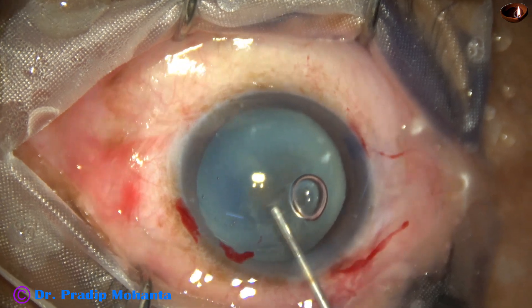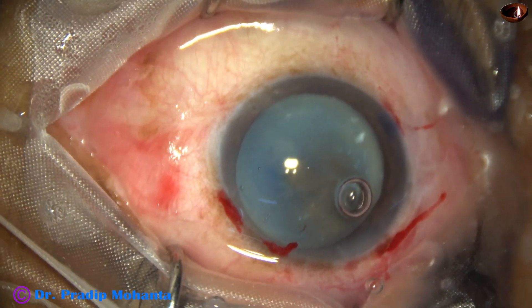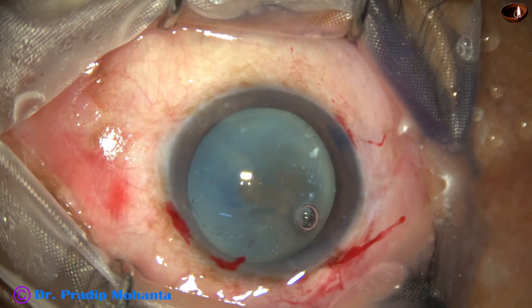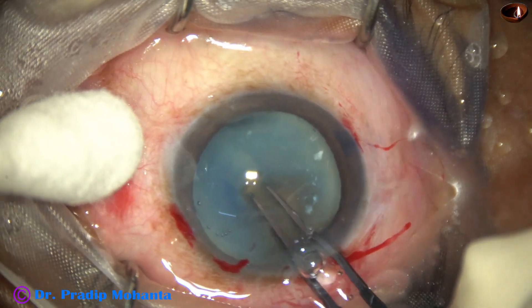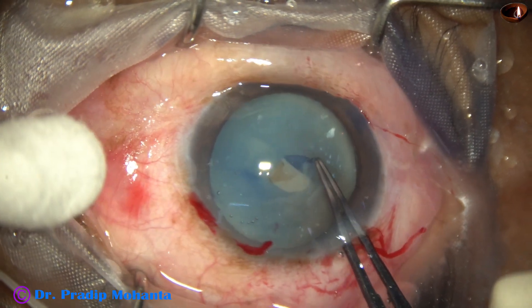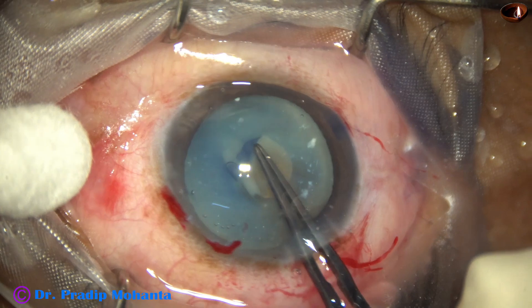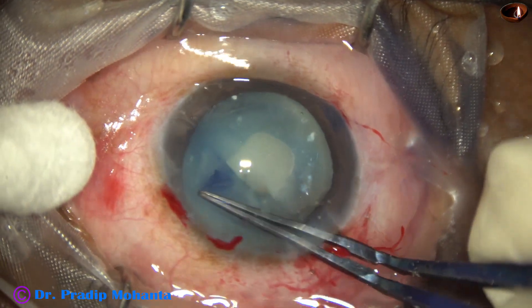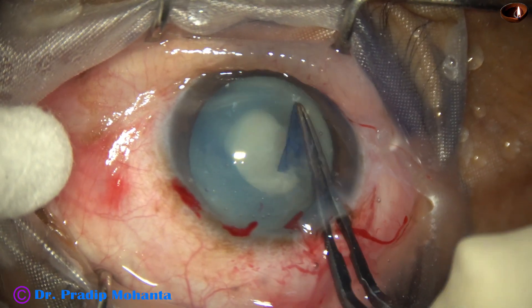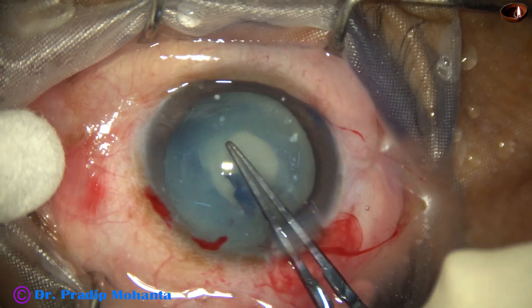And I try to do the capsulorhexis. In such cases, the zonule is weak and vigorous pull can cause zonular tear and even the bag may come out. But in this case, the zonule does not appear so weak and I am able to do a rhexis. But this is a small one, so I am going to go again all around. We can call this a spiral rhexis.